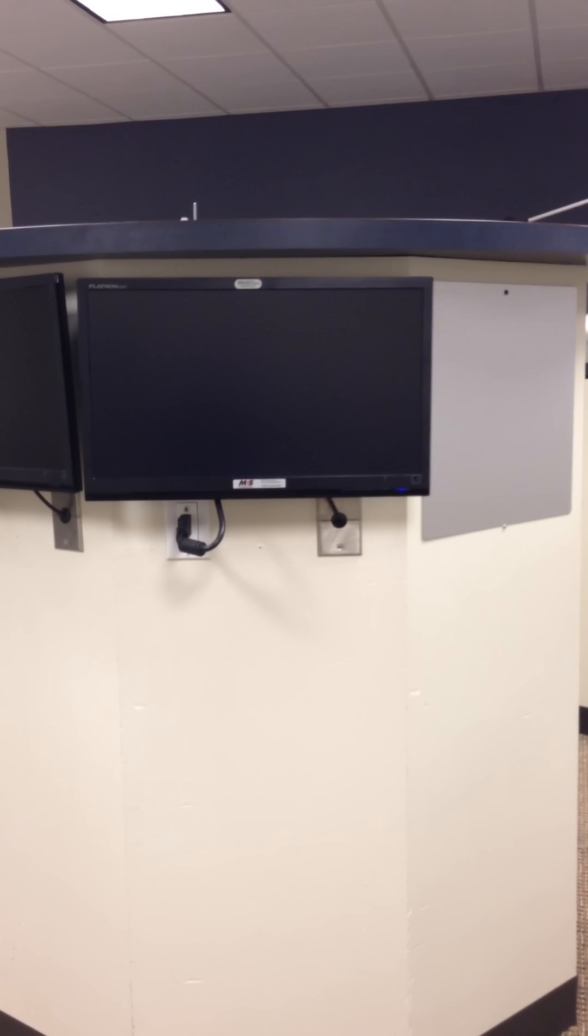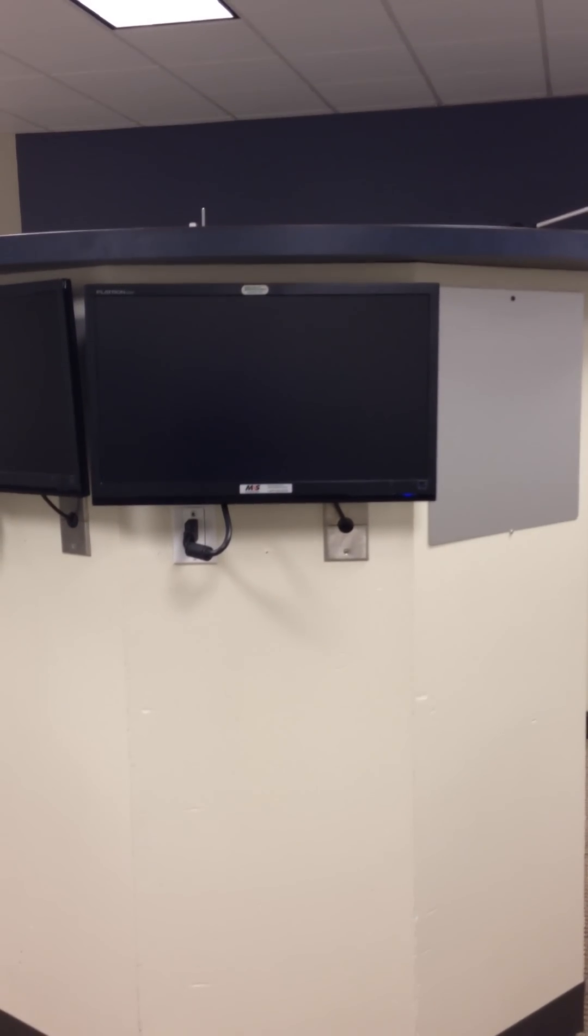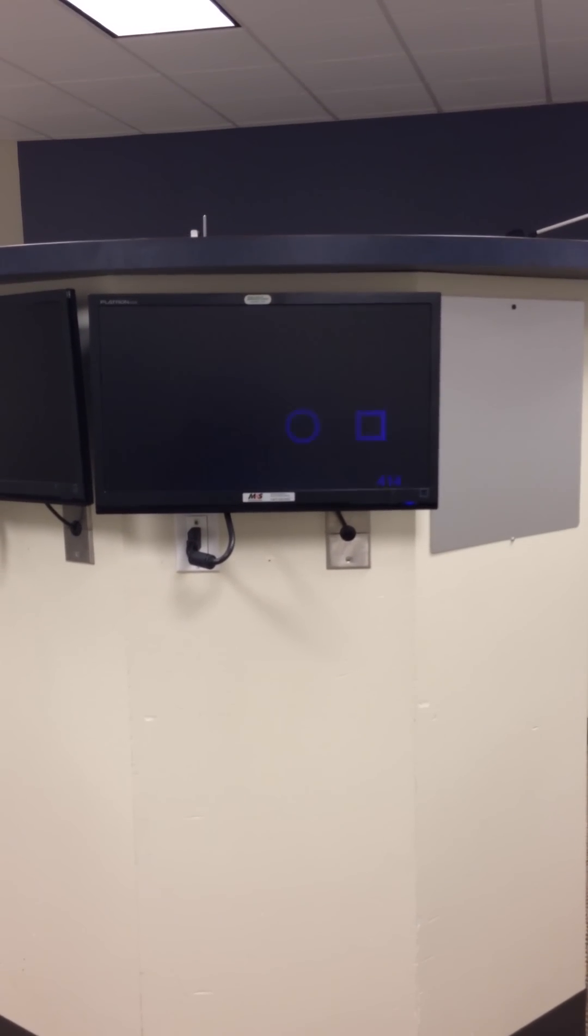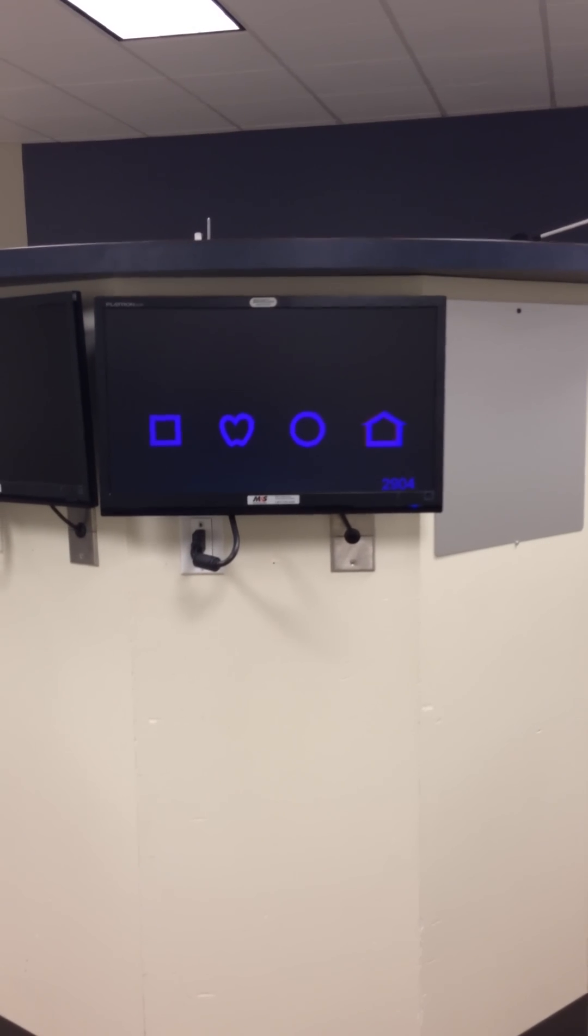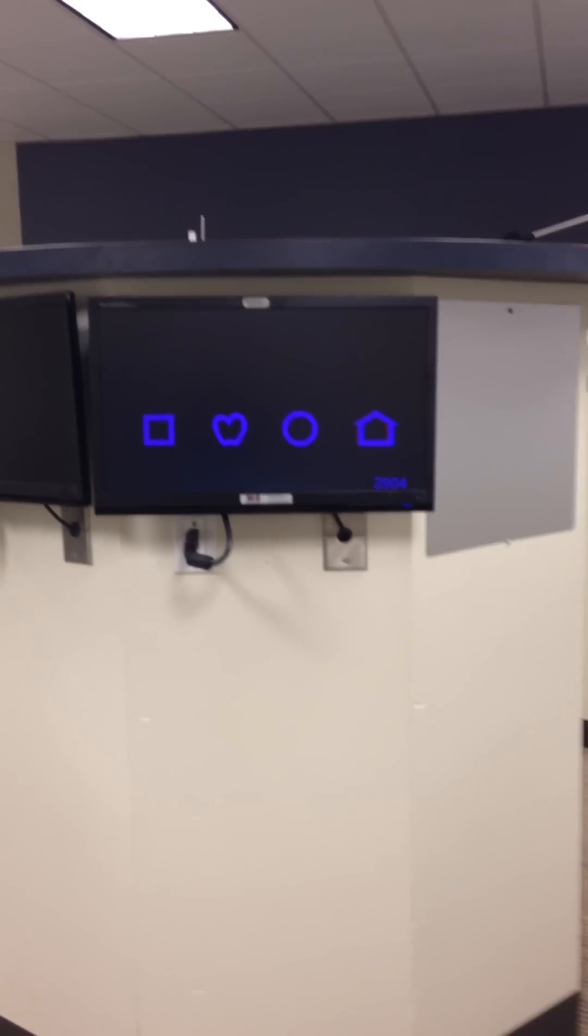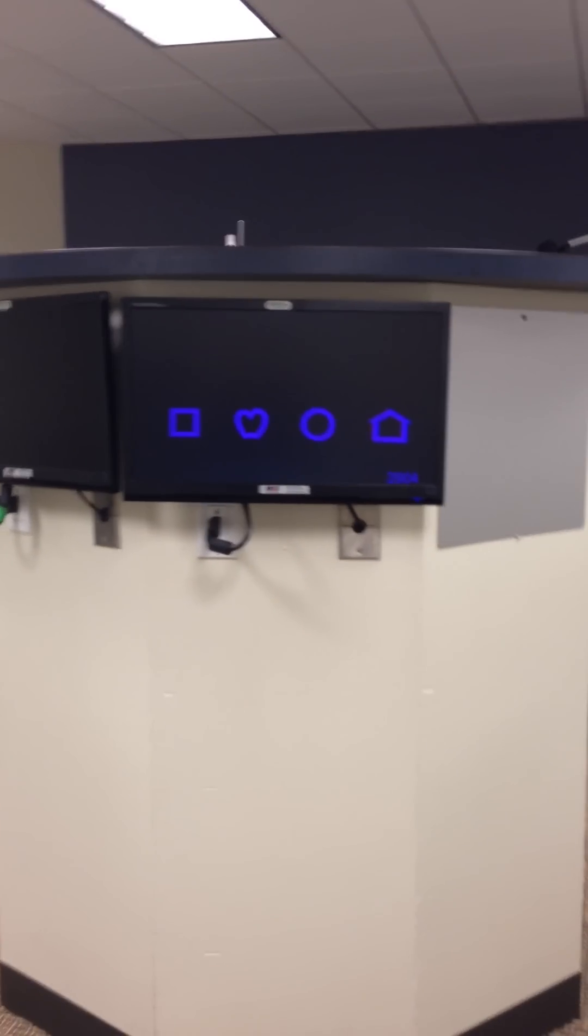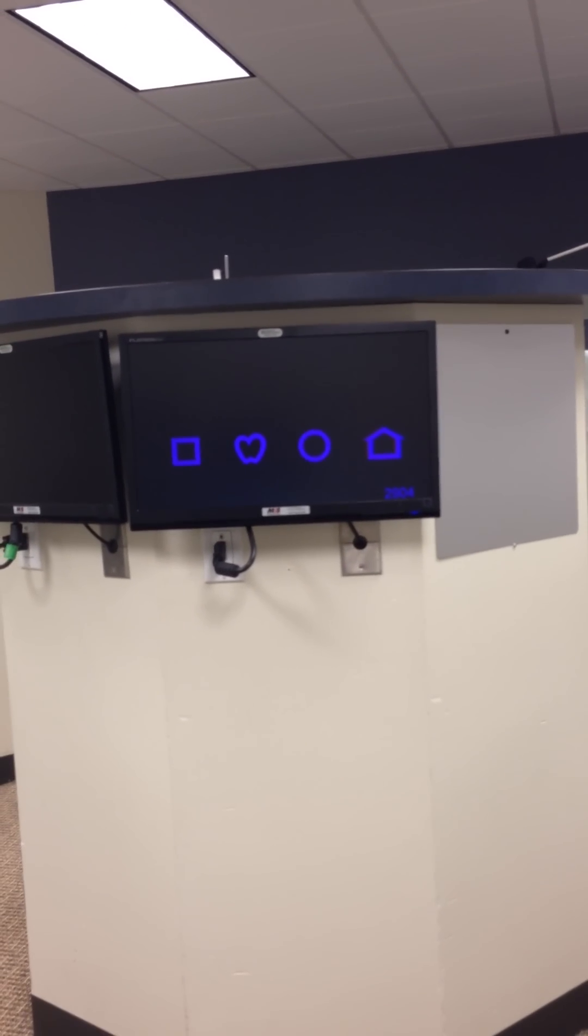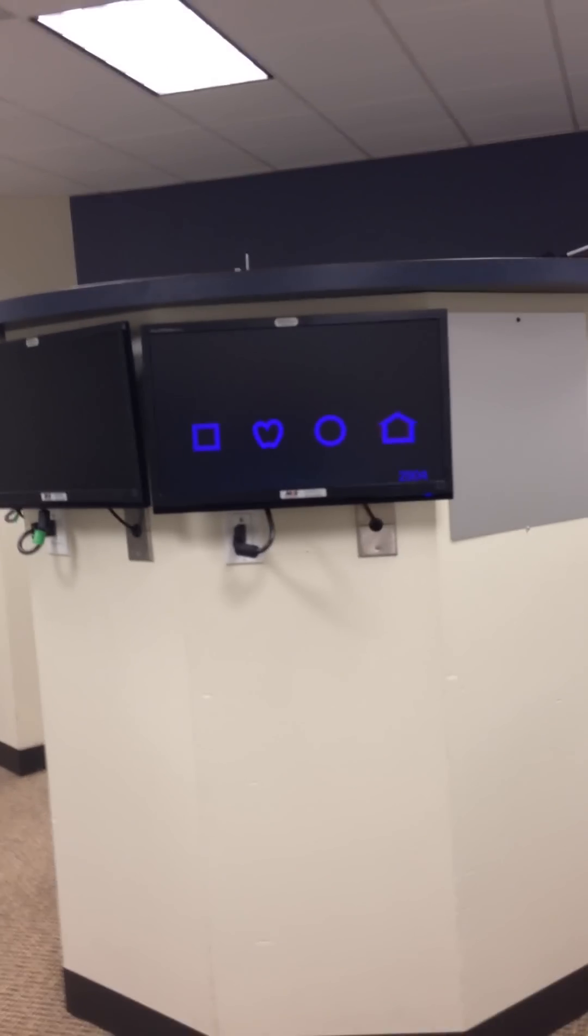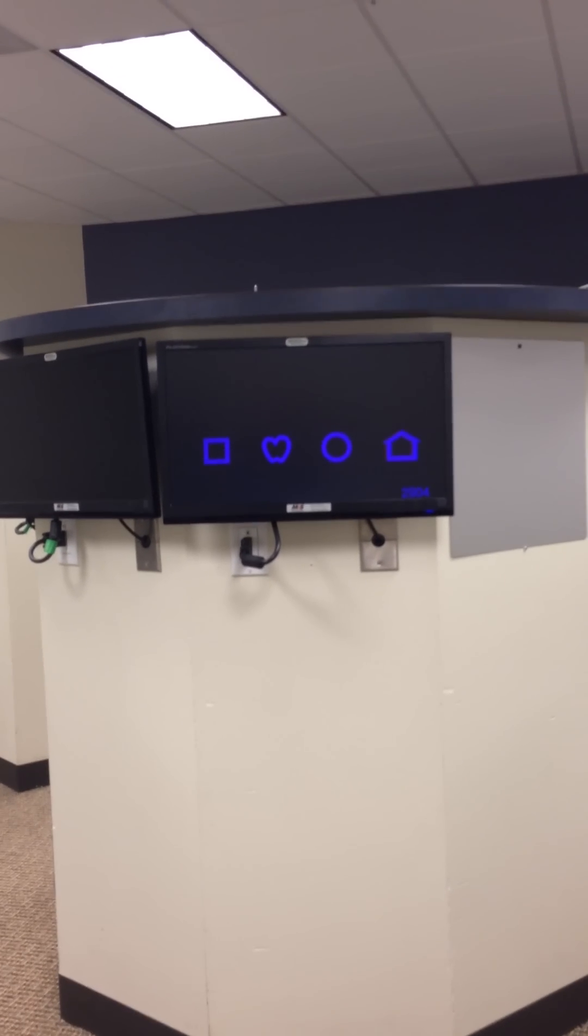And you can see how it goes. It may be a little different from lane to lane, and I will take all acceptable answers. And then it'll loop back around to the beginning. One of those four is popping out in a base out sort of direction. You need red and blue anaglyphs to be able to see it.